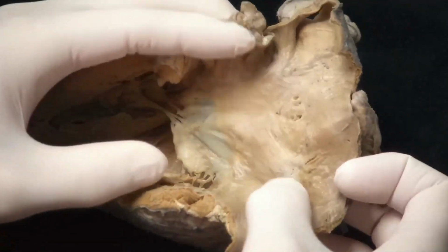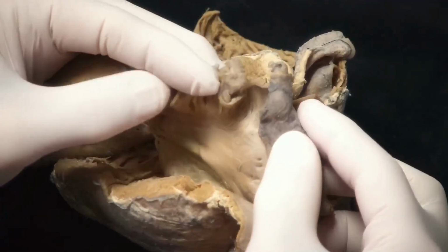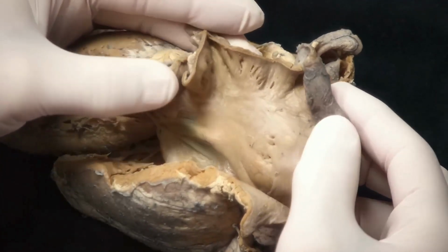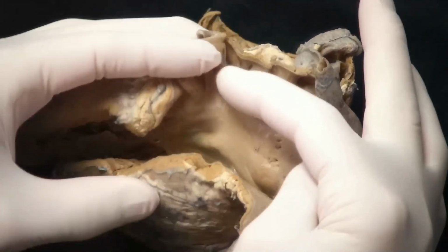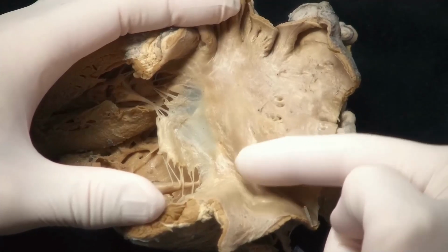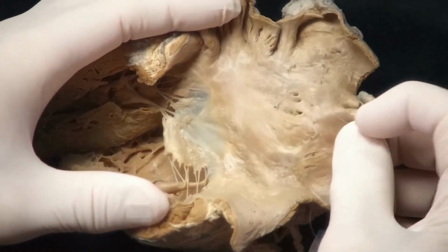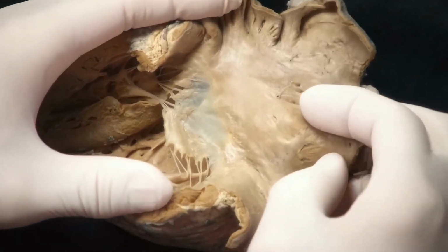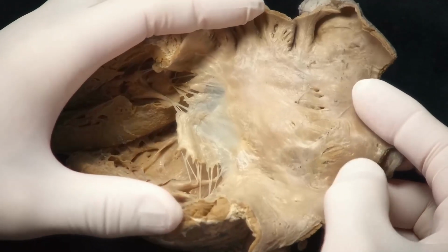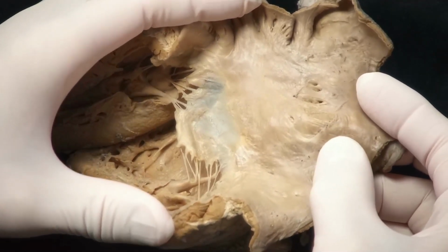For the LAA, the LAA generally sits in between the upper and the lower pulmonary veins, although it can be variable in its position, so much higher really on the left atrium. And for that, we've got to torque in a different direction, of course, to reach the left atrial appendage. So I would say it's not impossible to reach both from the same septal puncture, providing, of course, the atrial septum is not too dilated.